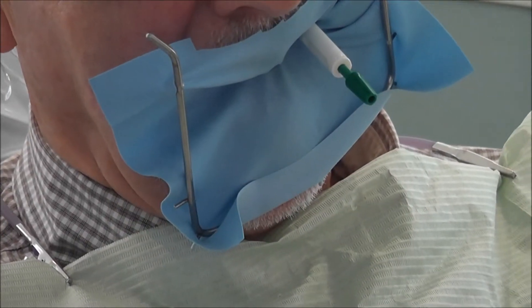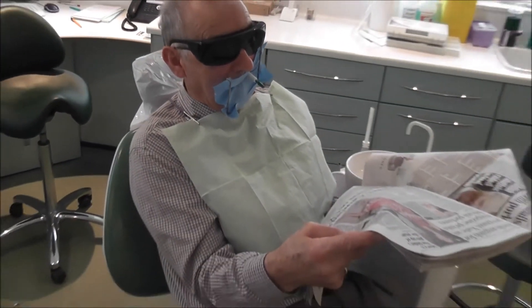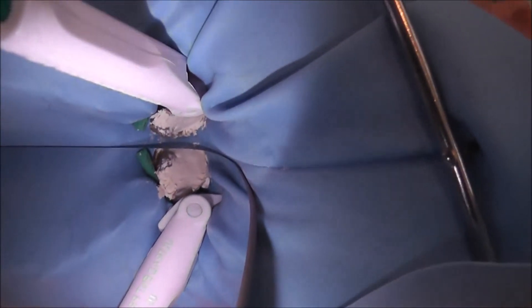We then leave it to set for 12 minutes. I normally sit the patient up and let them read the newspaper. Then once it has started to set, we remove the wedge of the band.